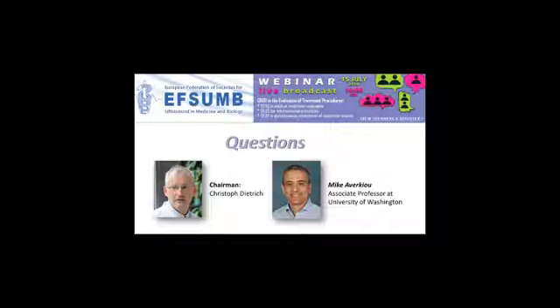Thank you so much. There's one question from Dr. Alexei Borsukov, and he is asking, if we make the radiofrequency ablation of 2 metastases at one time, is CEUS made separately for each focus, or is it possible to combine these studies with evaluation of only the portovenous and deferred venous contrast phases, where the arterial phase is rather short and you may evaluate only one focus?